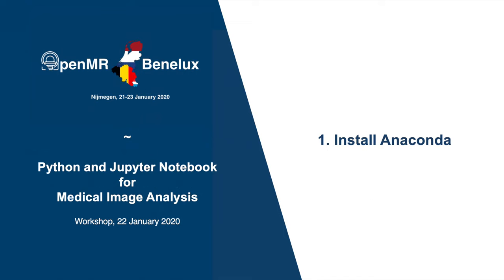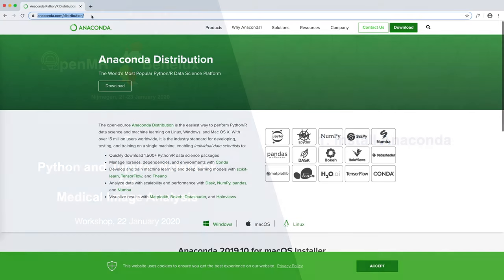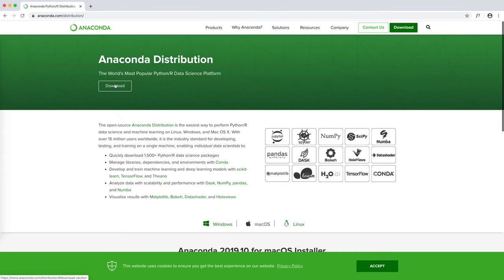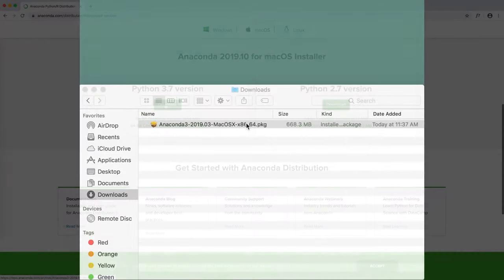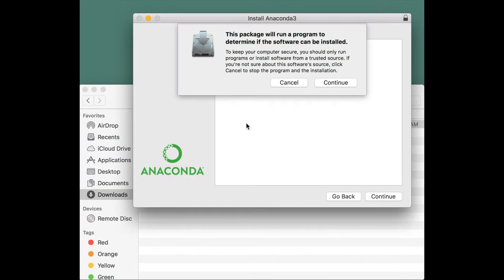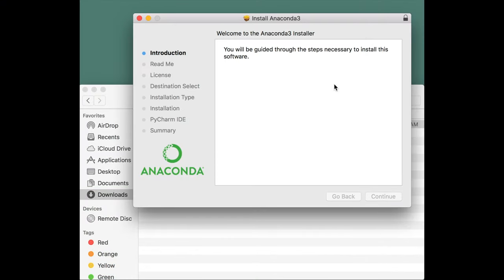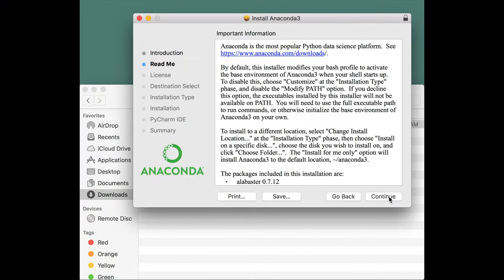The first thing to do is to install Anaconda, a Python platform. To do so, go to anaconda.com/distribution and click on download. Select your operating system and click on download. Once downloaded, install Anaconda as you would do for any software.